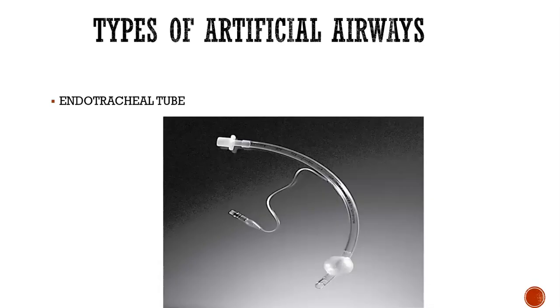So it's, you know, 22 centimeters at the lip, or 22 centimeters at the teeth. But it just depends, and always make sure that when you're documenting, when you come onto shift, you should always look to see where your ET tube is and see where it was documented at last.